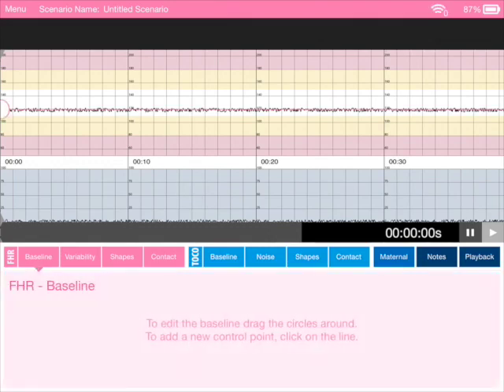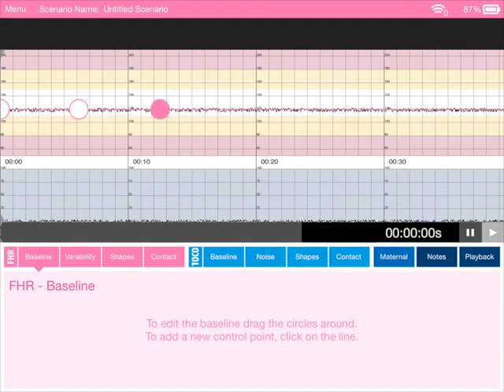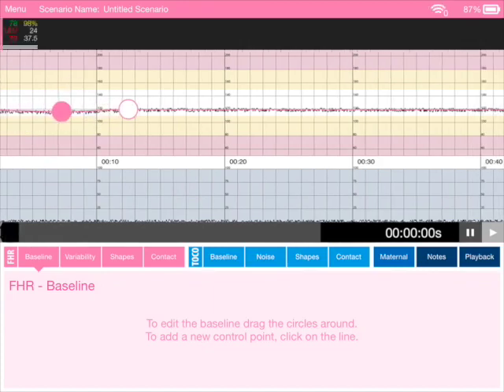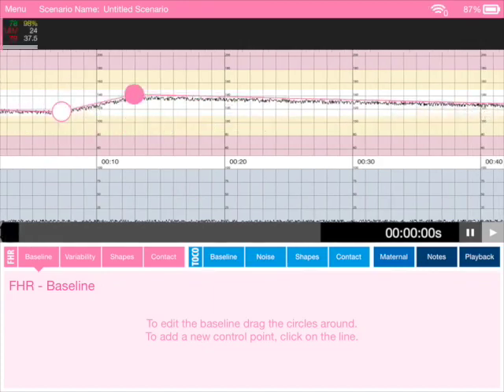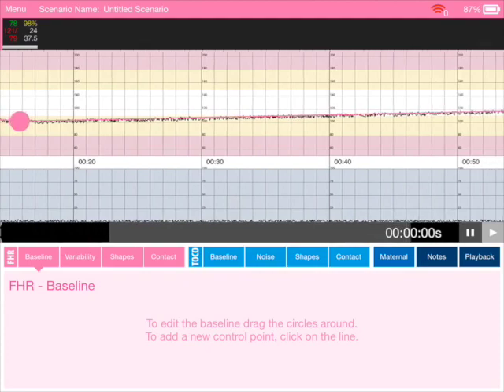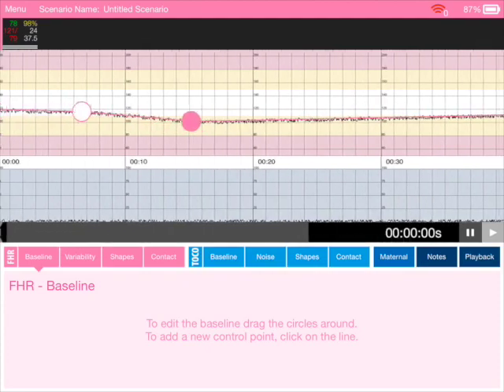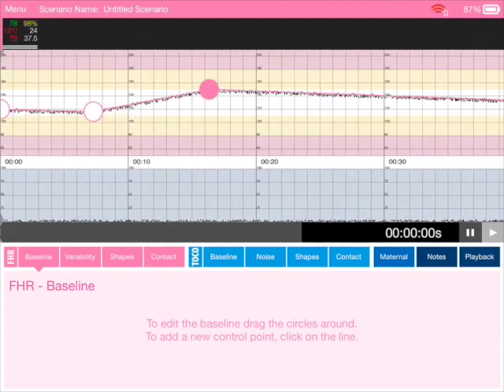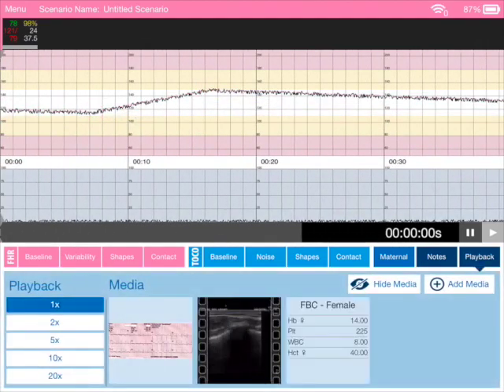Let's tap on fetal heart rate baseline here, and what you can see is we've got a horizontal pink line. We can just add some dots to that. You can move these dots around wherever you want. Look at that, so easy to move. As you can see, I can scroll through the trace here, backwards and forwards. Then if I hit playback, you can just see how the trace has changed.